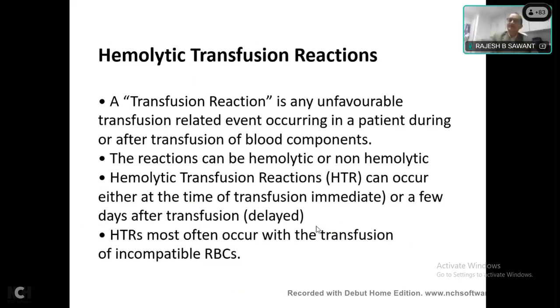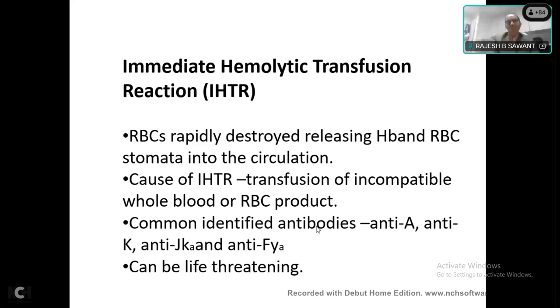Okay, so hemolytic transfusion reactions can be nightmarish. These actually occur mainly because of human errors and not because of any failure to detect the corresponding antigen or antibody. About 70% of them still happen because of human errors. The correct cross matching was done, everything was right, but only when it went to the clinical area, patient A's blood was given to patient B, something like that, right? So hemolytic transfusion reactions will lead to massive hemolysis and renal shutdown. So you all should be well conversant with how to take care of an adverse transfusion reaction.